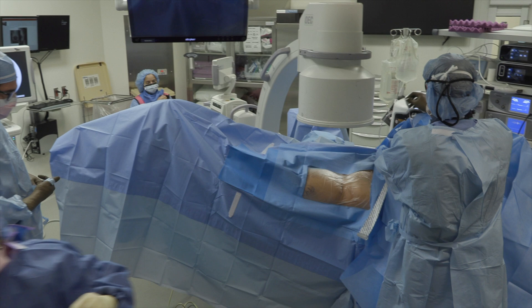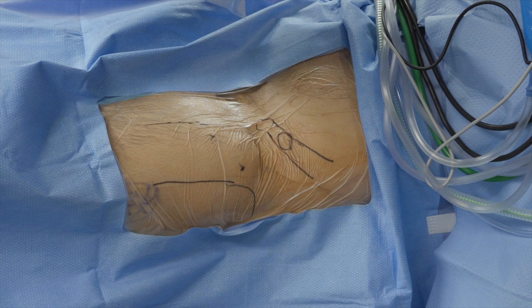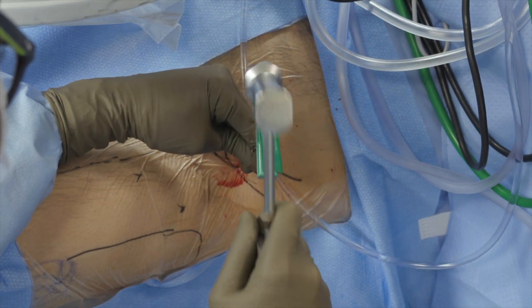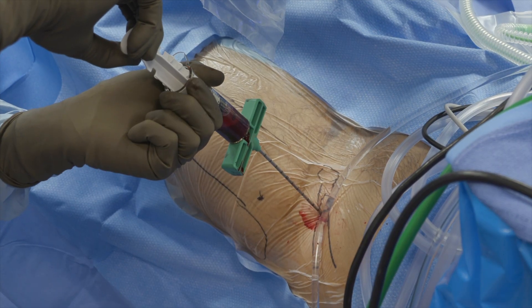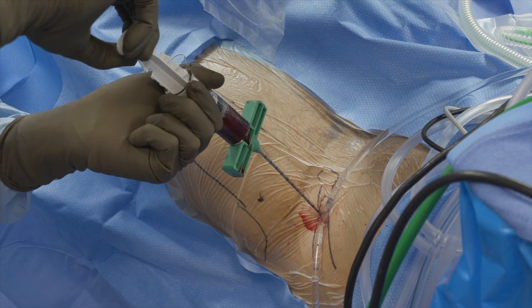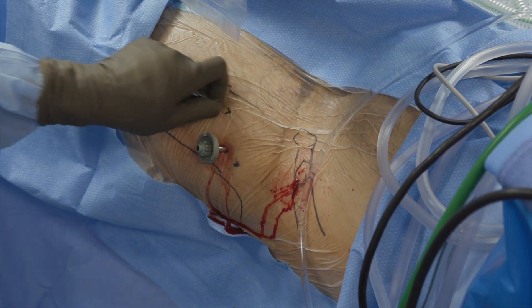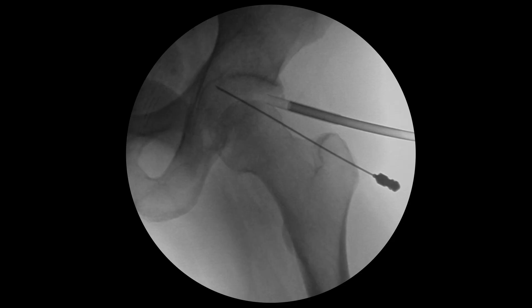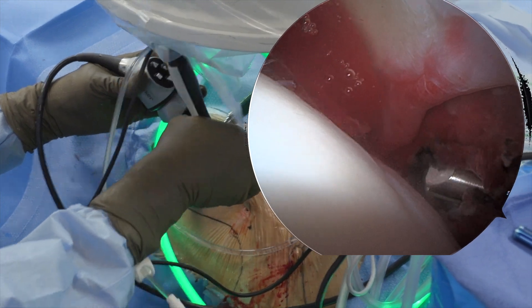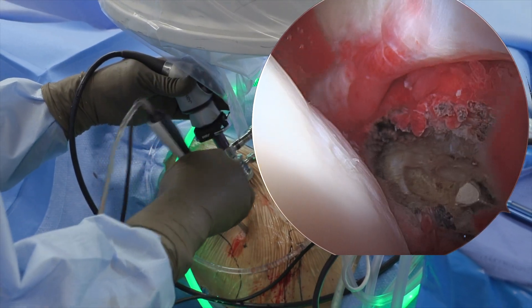After hip distraction, the patient was prepped and draped in the standard fashion. First, bone marrow aspirate was extracted from the anterior iliac crest. Hip arthroscopy was begun through the anterolateral and mid-anterior portals. Through the mid-anterior portal, a partial capsulotomy was performed between the two portals.